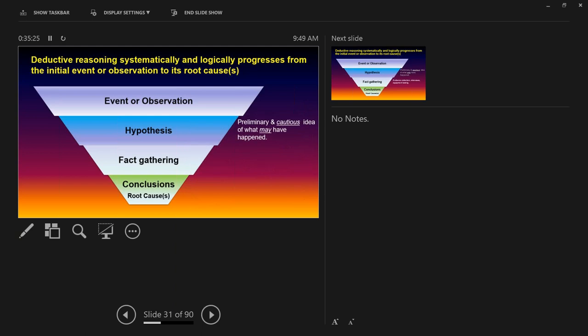work that out. Okay. Even if it's true, even if they screwed up, you want to be very careful about assuming that. So you start off with some preliminary ideas, and you almost have to hold these close to the vest. Be careful about who you start sharing your initial suspicions with. You start out with some kind of idea of what may have happened. Collect as much evidence as you possibly can. This is through photographs, the error log downloads, we'll see a bit of that, and gather as much information as you can, which can be difficult, as we'll see in a bit.